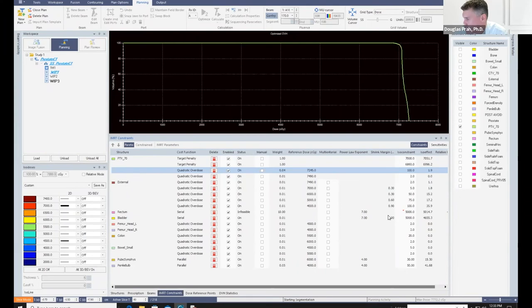All right, well, let's go on. Are there any other questions that we could answer maybe while we're waiting? Yes, Dr. Pop. Another question is, is it usual to use the underdose DVH for coverage? I would prefer to not use the underdose DVH.